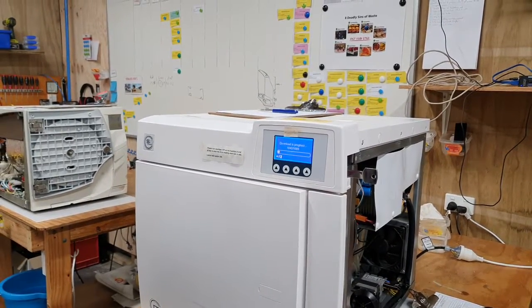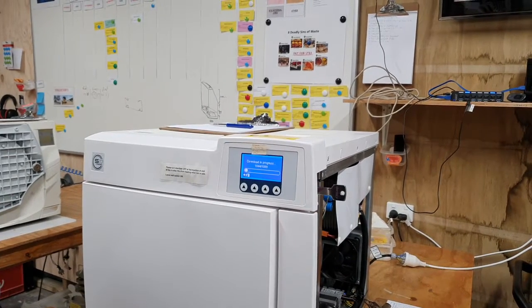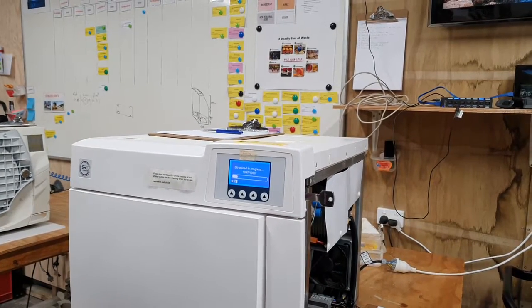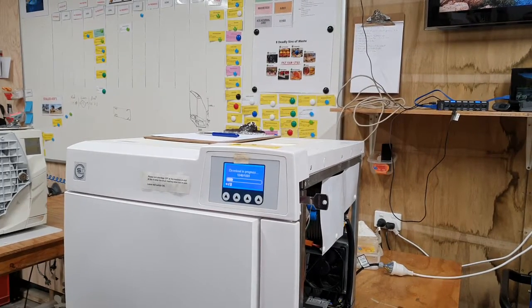And then when it's completed that, there's a couple of things. First off, like in the workshop for us, we don't want to use the new menu. We want to download like the last 10 or the last 50. 50 gives us a good number to look at some historical and see what's happening. If we use the new, that's the one the client uses.